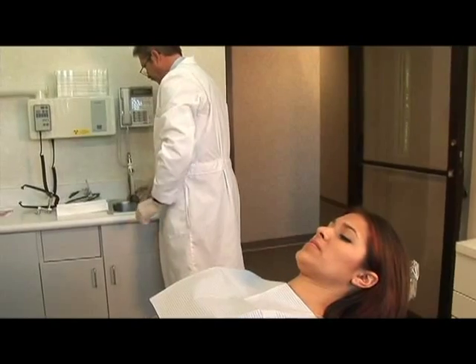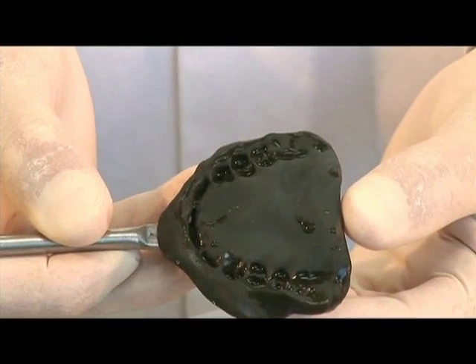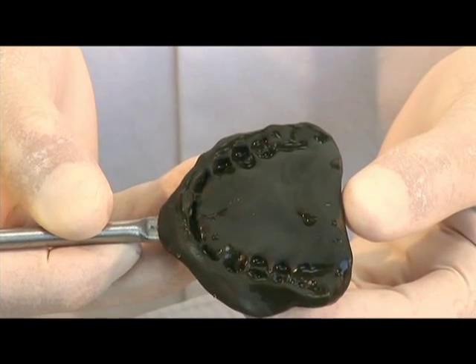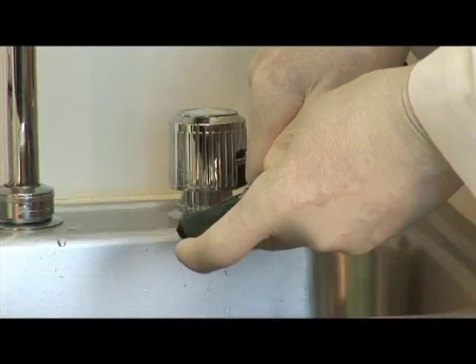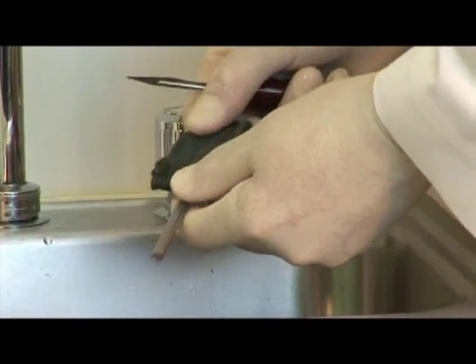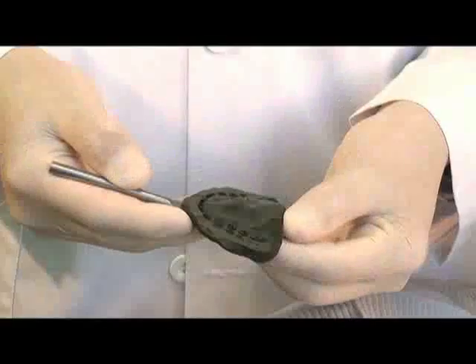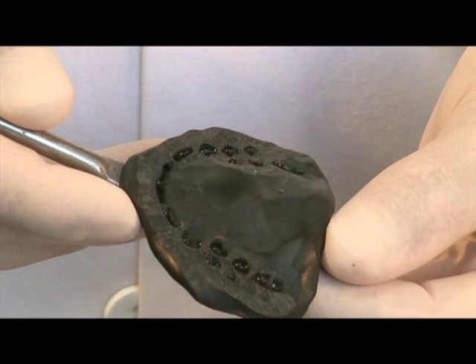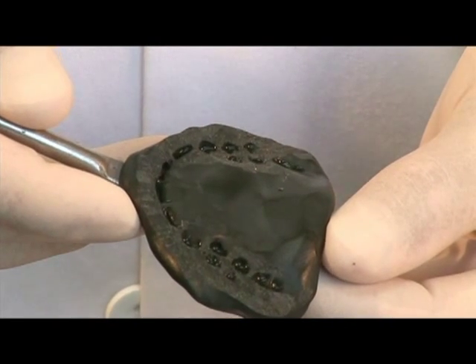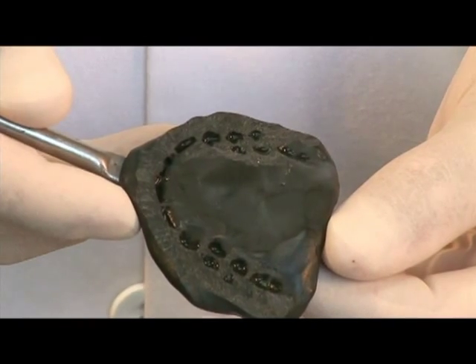Rinse the impression compound under cold water. Inspect the registration for any soft tissue or deep occlusal registrations. Any excess can be trimmed away with a Bard-Parker blade. The final bite fork with impression compound should have only cusp tips and incisal edges registered and no perforations through to the metal.